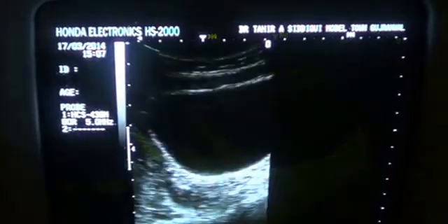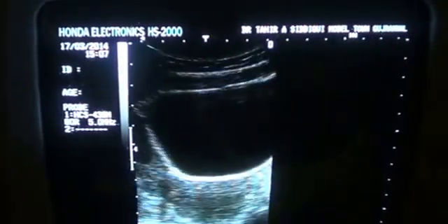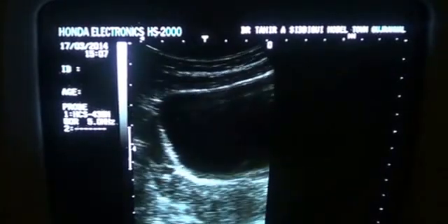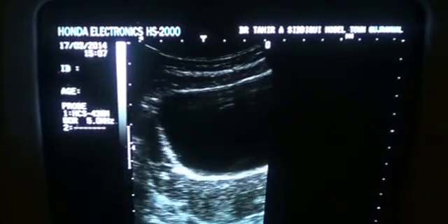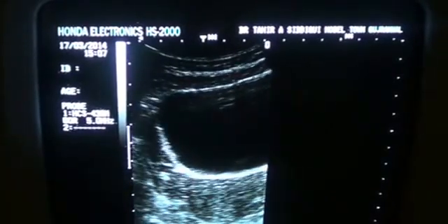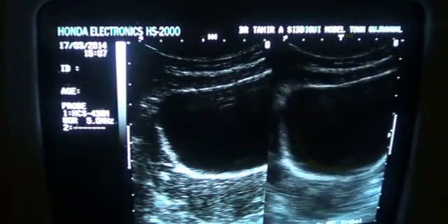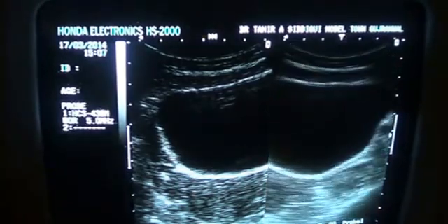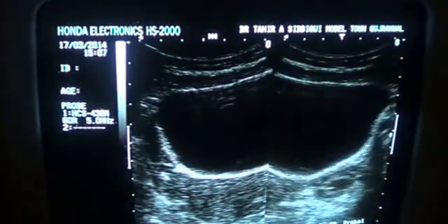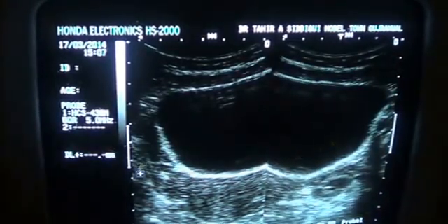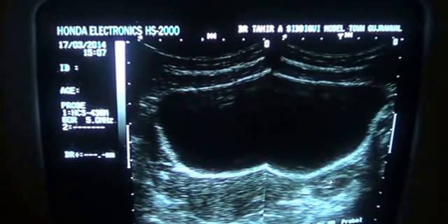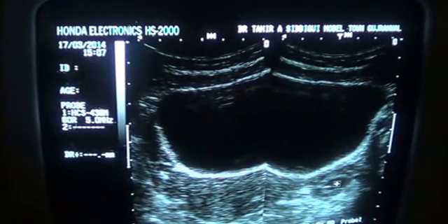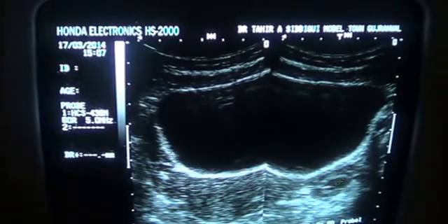With follicles seen in different stages of development — this being the right ovary — both ovaries are identified. Both ovaries can be seen with a dominant follicle in the left ovary.